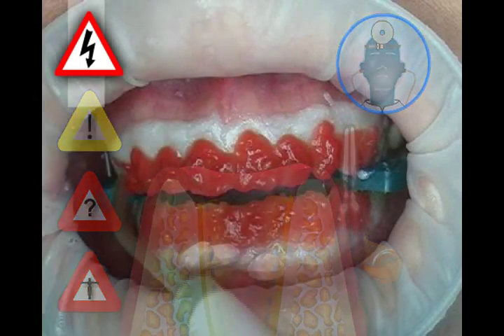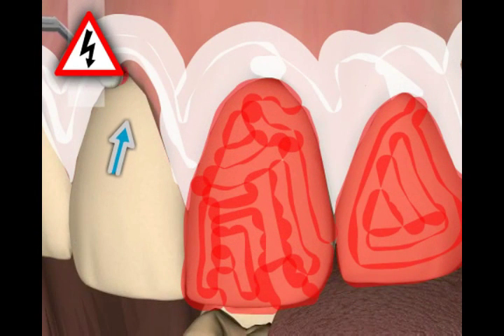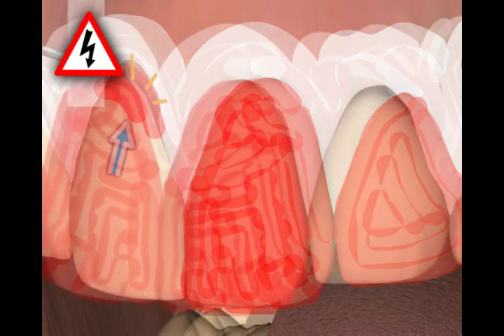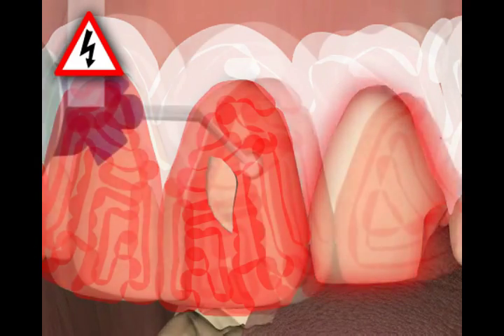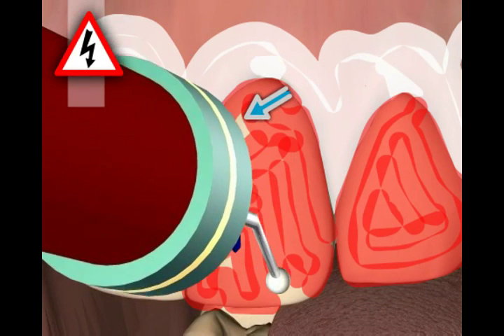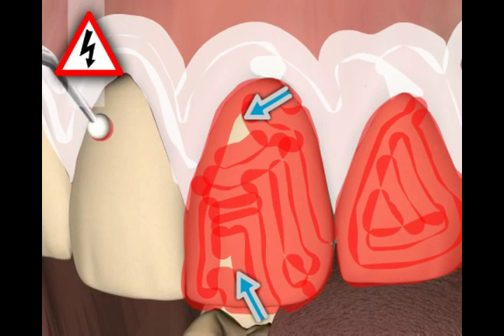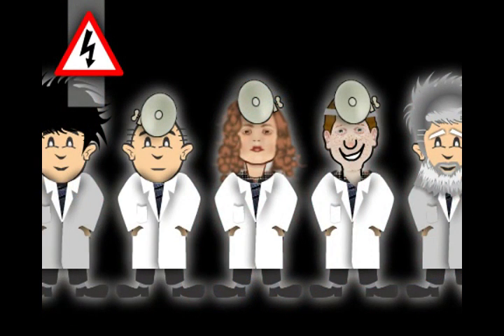At this point in our discussion, we will only deal with the specific complications encountered in bleaching. These complications are, for instance, sensitive tooth necks, for example in the case of a careless application of the bleaching substance; toothache, perhaps in the case of leaky fillings; spotty teeth, which could result from the incomplete covering of the tooth with the bleaching gel. However, all of these complications can be prevented with careful work.